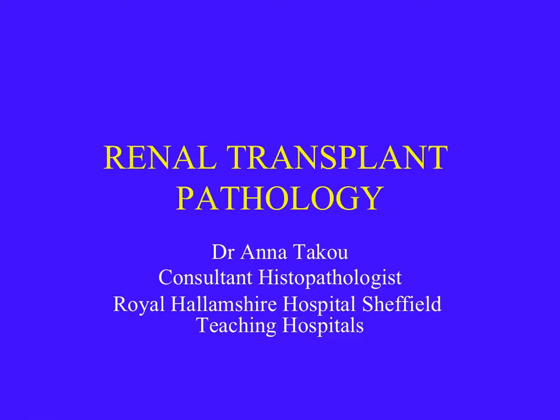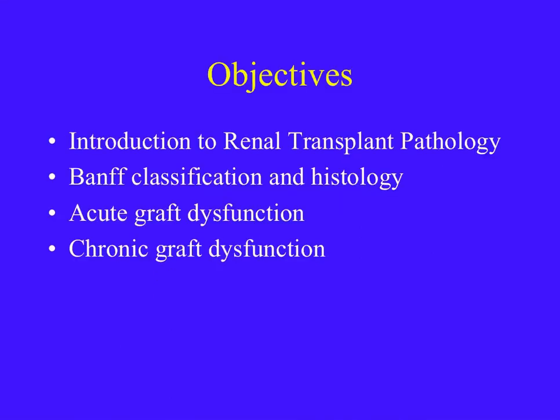Hello, I'm Dr. Takou, consultant histopathologist at the Royal Hallamshire Hospital in Sheffield, and today we will discuss renal transplant pathology, the Banff classification and its applications to the assessment of renal transplant biopsies, and we will go through briefly the commonest causes of acute and chronic graft dysfunction.